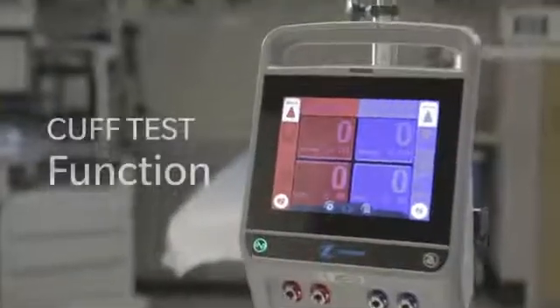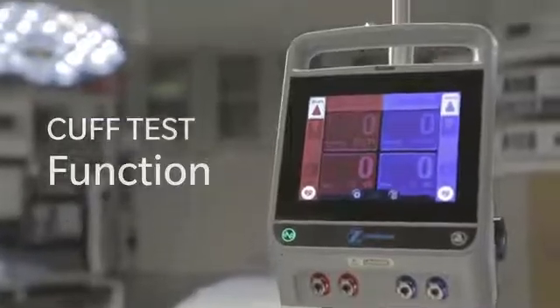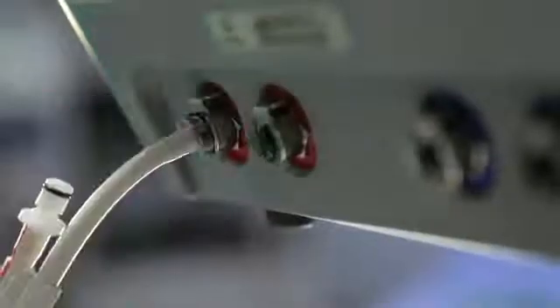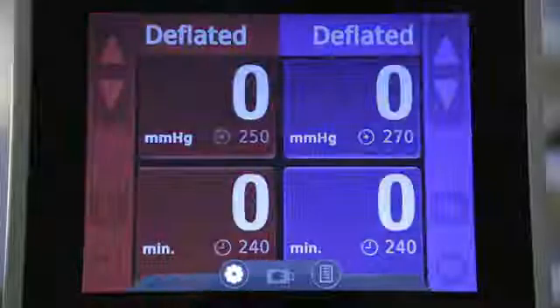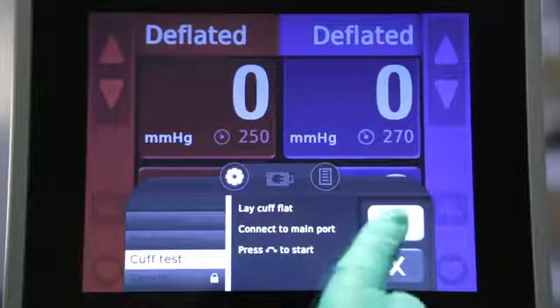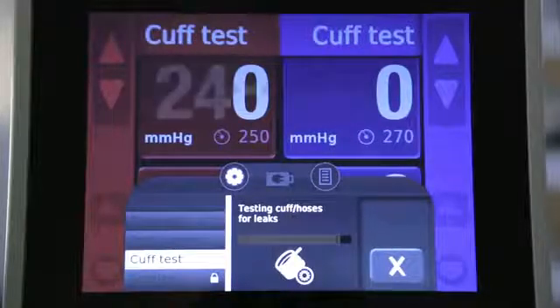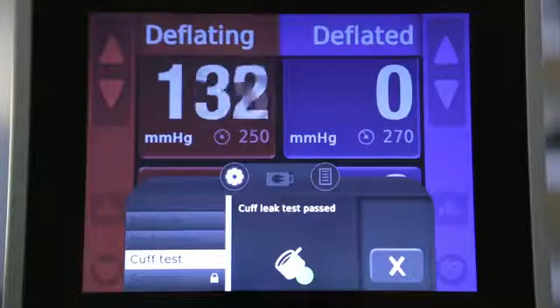The ATS 4000 also includes an exclusive pre-op cuff test function. To test the cuff for leaks, connect the cuff to the main cuff ports. Tap the settings icon, then the cuff test menu button. Tap the next button to begin the cuff test. A testing view appears showing an animated progress bar. When complete, the display shows pass, leak detected, or error.